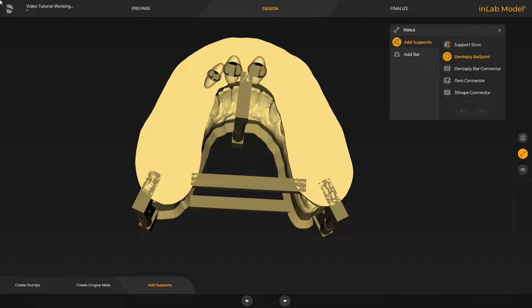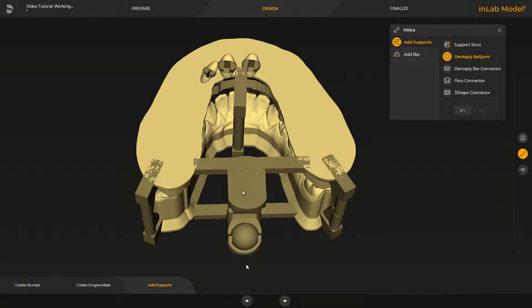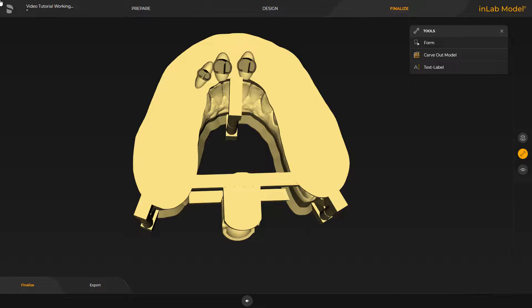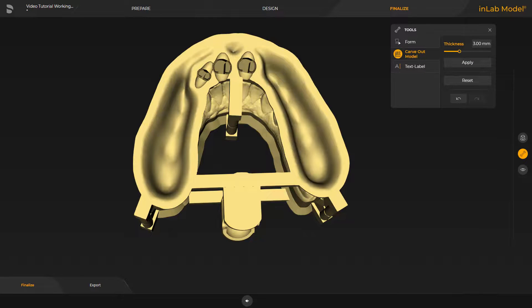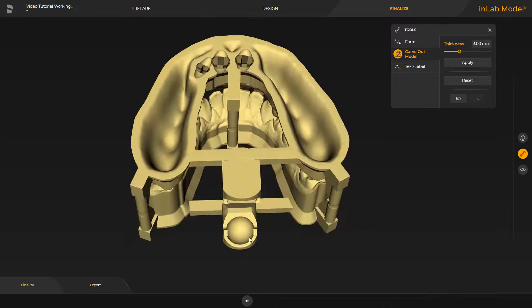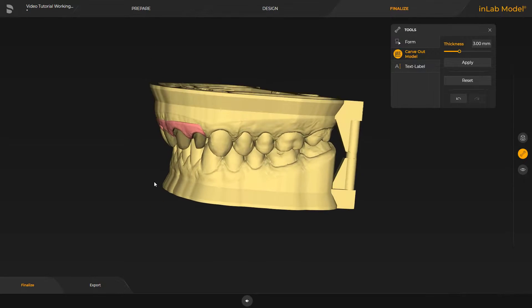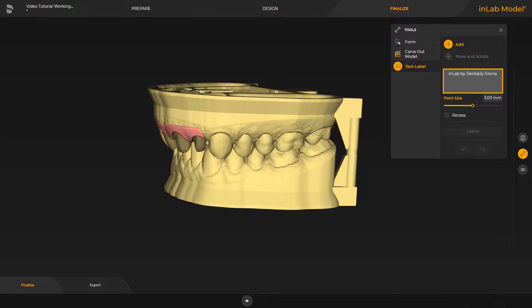Here, too, we determine the position with a double-click. Now we switch to the last phase, the Finalize phase. In this phase, we will also take a look at the Carve Out Model and Text Label tools. By tapping Apply, the model is hollowed out according to the selected thickness. Finally, we put some text on the models so that they can be matched to a patient, for example. After the text has been entered, we move the cursor to a suitable location and place the text with a click.